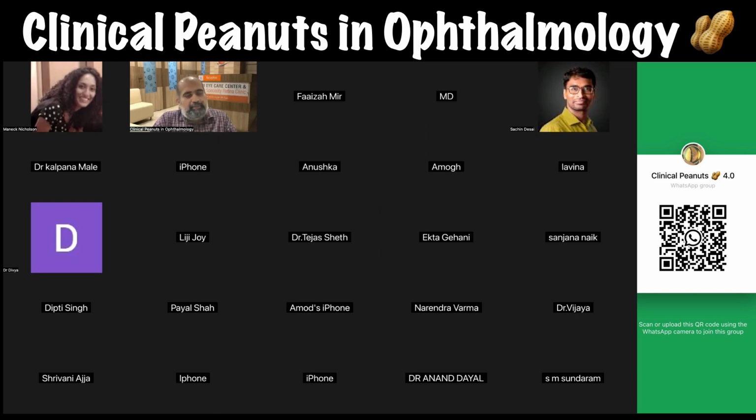So I think if you're starting out as a cataract surgeon, the first most important prerequisite is to be sure that you can do a good phaco. If you're confident of your surgical skills when it comes to phacoemulsification, I don't think there's anything that can really stop you from placing a toric lens in the bag, because it's essentially the same surgery as regular phacoemulsification.